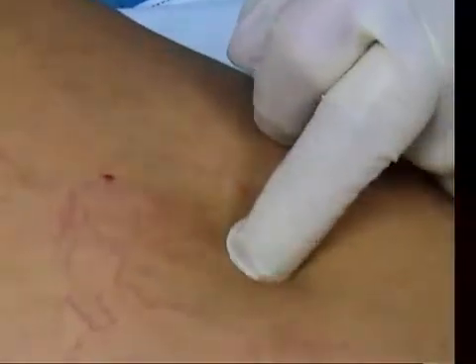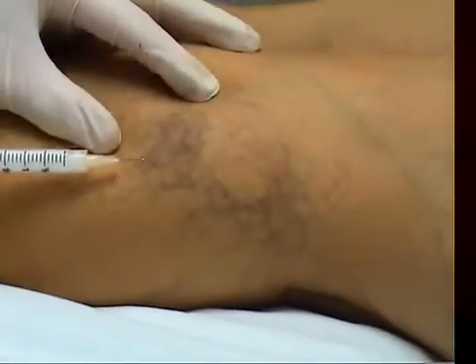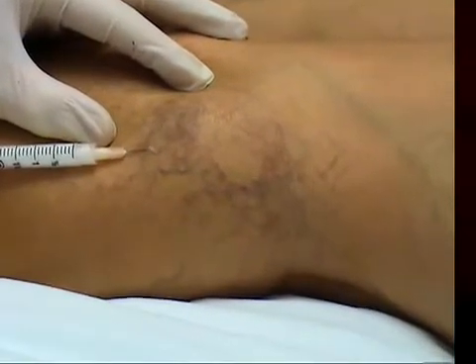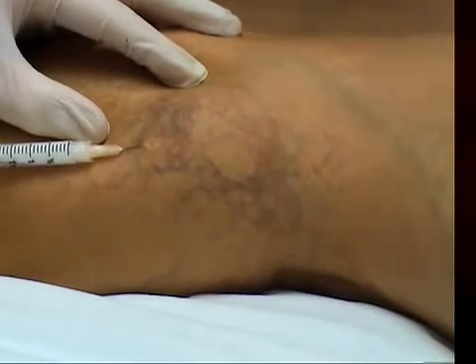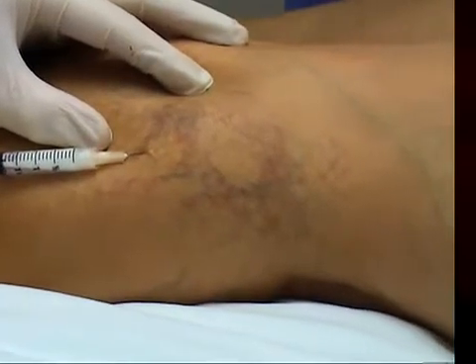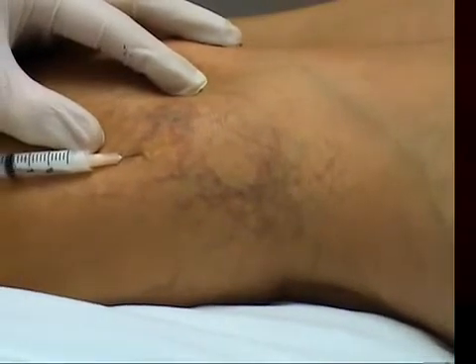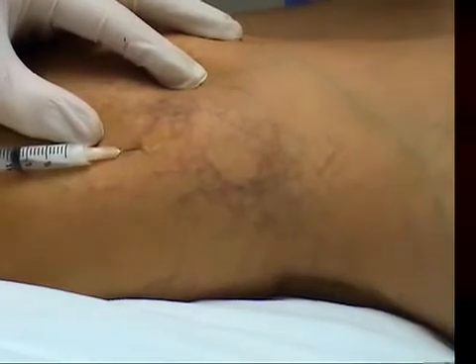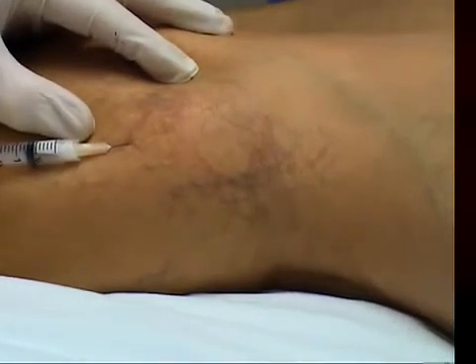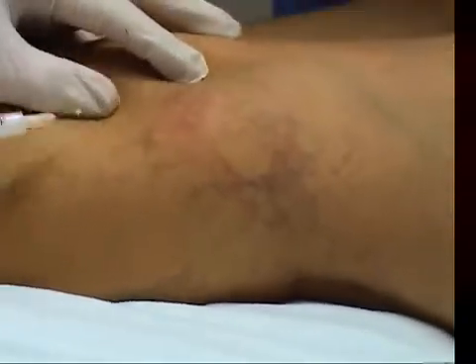This is a good-sized vascular complex. Just going to bend the needle up a little bit. We're using foam 0.1% in that vessel there, and then you'll see it gradually filling. You have to put a fair amount of pressure on this — it's different to the regular 0.1% sotradecol — but don't put too much force otherwise you'll extravasate. You can see it gradually filling up, and then once it fills up it'll take some time for the blood to come back. You can see right at the tip of the needle there's a bit of extravasation, so I'm going to stop there and go over here.